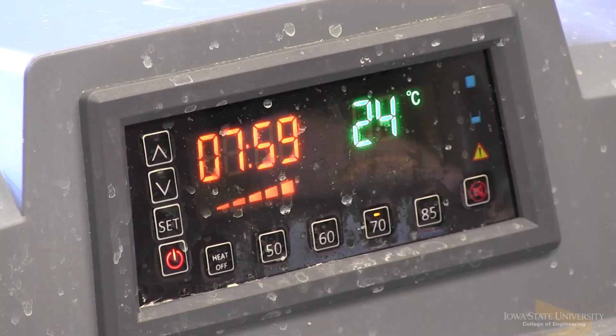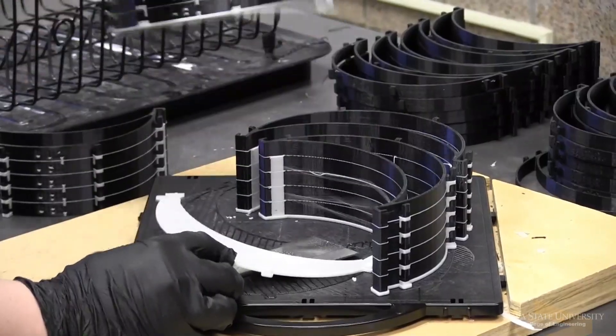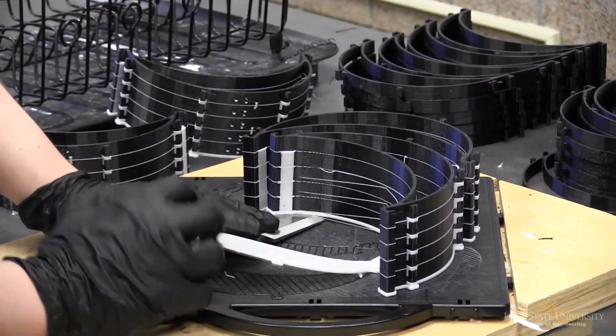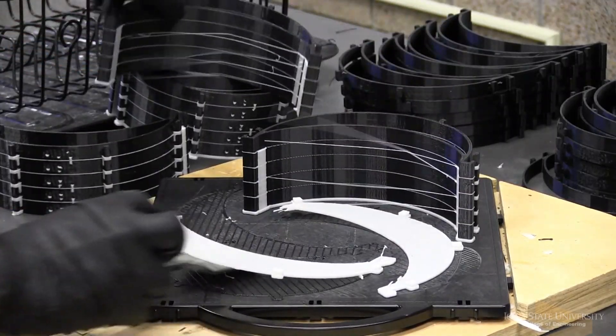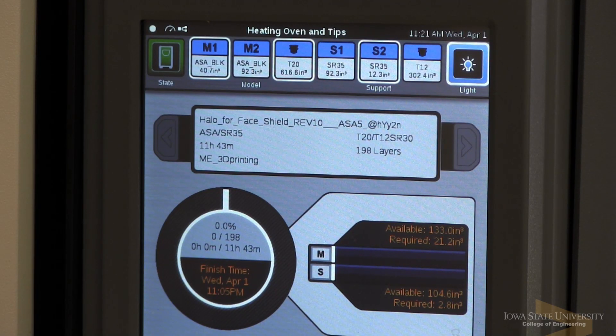In total I'm producing about a hundred parts per day. One of the benefits to 3D printing — while it's not quite as fast as some of the more manual methods that the Boyd Lab is using — is that we're able to run a lights-out scenario. I can start a print at 9 in the morning, go home, and come back the next day to a hundred parts finished.